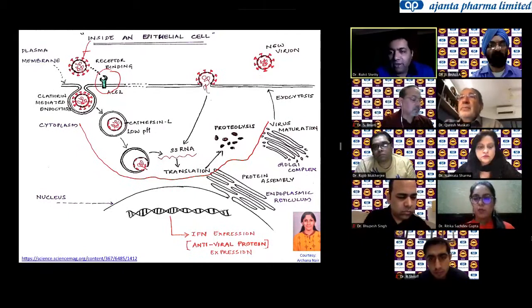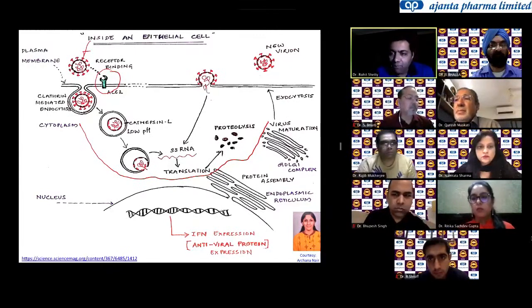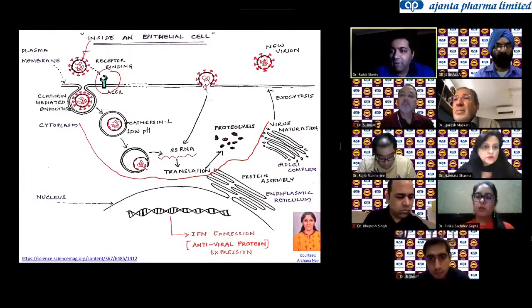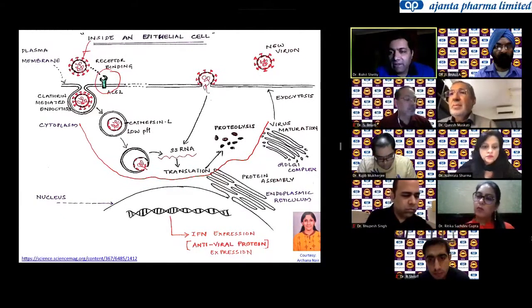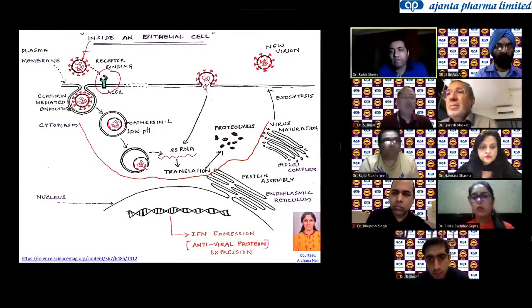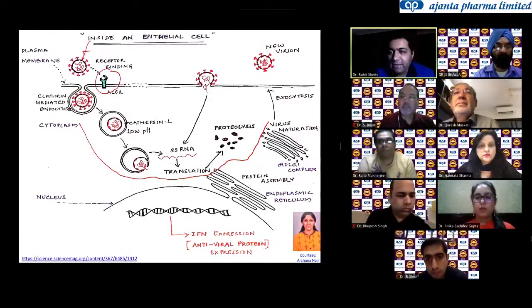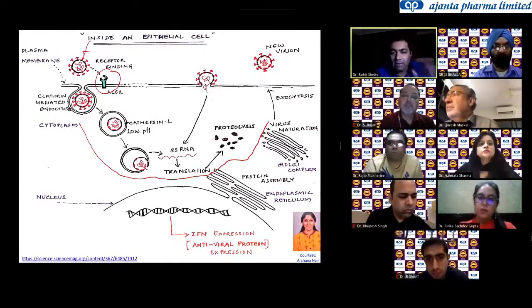But when you're using alcohol or debriding manually, you have a very high potential chance because of fluid. The aerosols can go up to around 3 to 4 centimeters, to 8 centimeters around your space, and that is the space where you are sitting, where the microscope and your laser machine are. So laser in that way would be much better because you're not creating that aerosol. This is again a hypothesis. But with this picture, we have to understand that there is a huge risk of epithelium floating around.